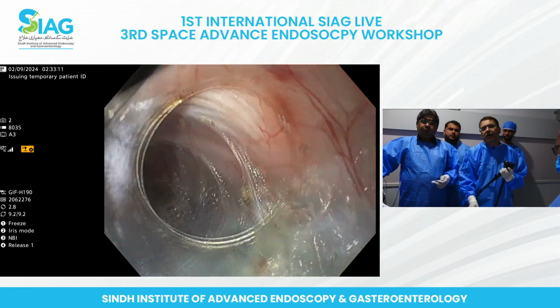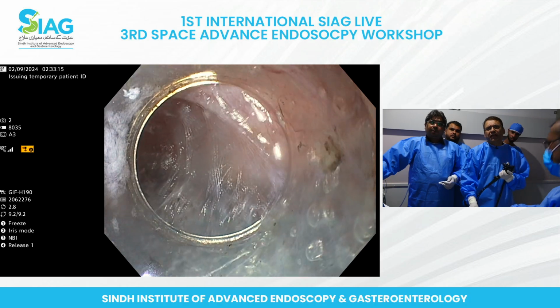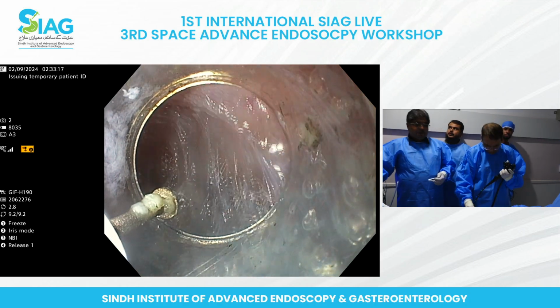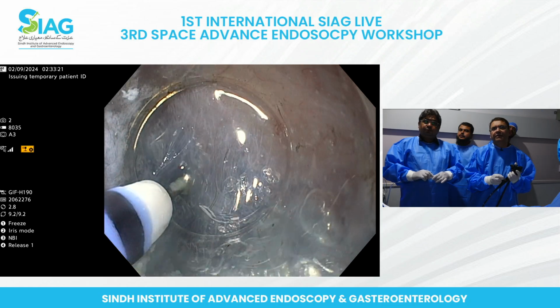I think I'm tilting a little bit towards the left side. So I'll open up from the right side now a little bit, but before that I'll inject this.